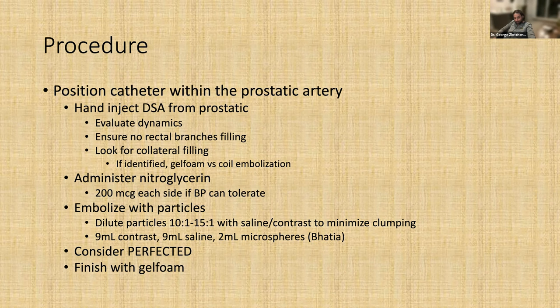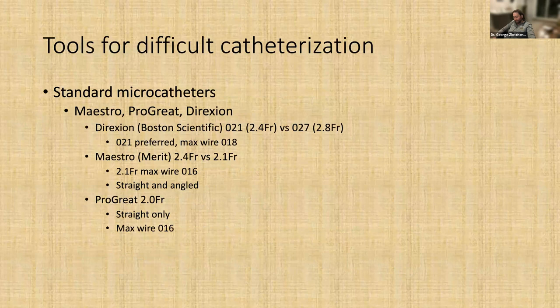And I used to do gel foam. This is not essential, but you can gel foam the internal iliac arteries when you're done if you want to improve your result. But I think if you're able to do the PErFecTED technique, gel foam is just overkill.